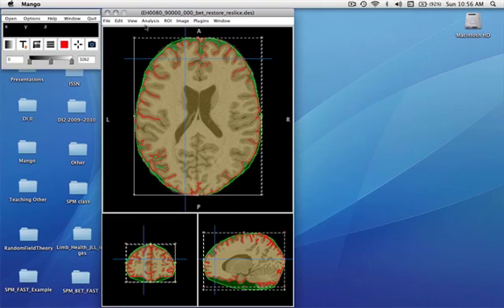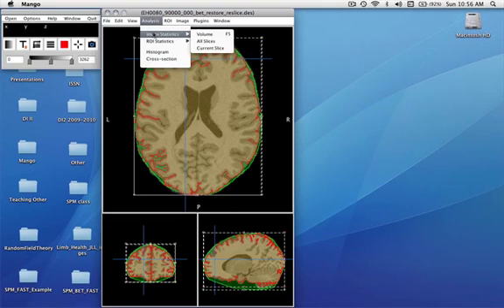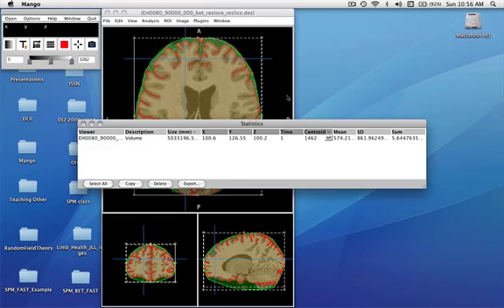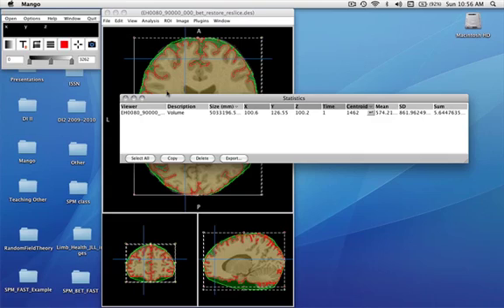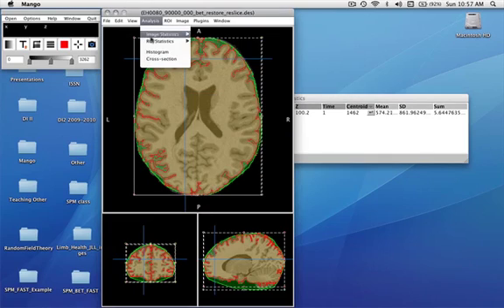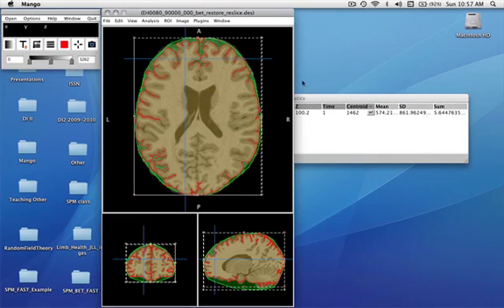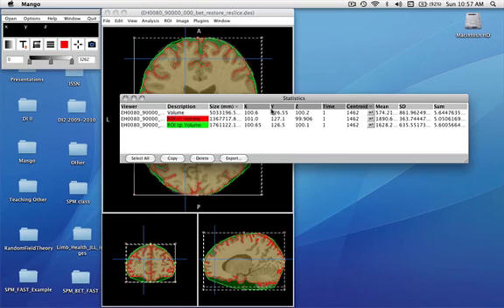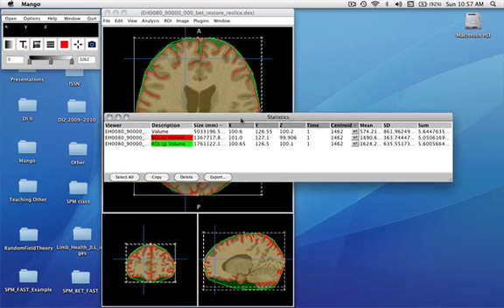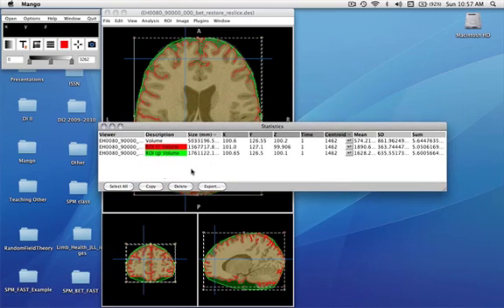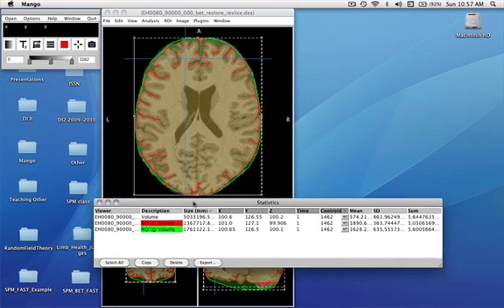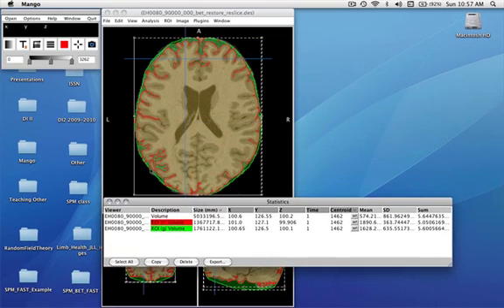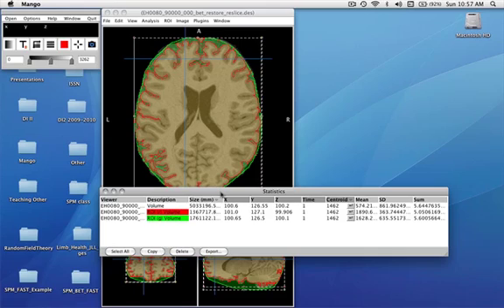This is the statistics for the entire volume. This is basically the size of the volume. But we can also, now that we have regions, get statistics within each of the regions. This is the volume of the brain, including all of those interior things, but excluding mostly the superficial CSF. And this is the volume of the convex hull.